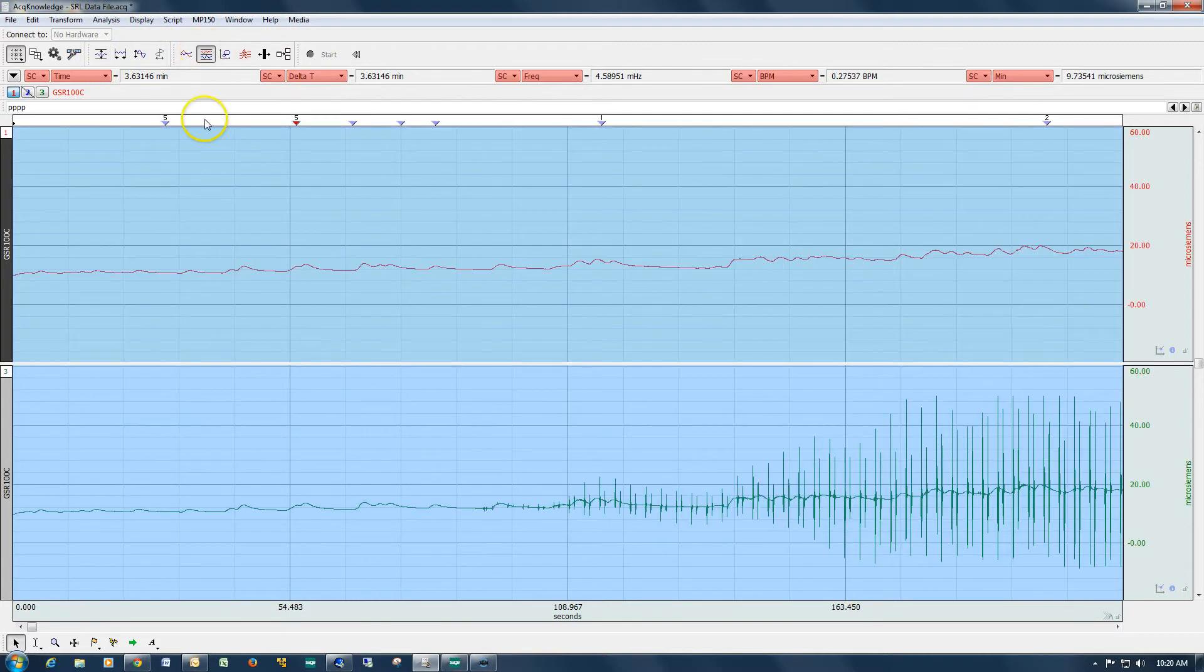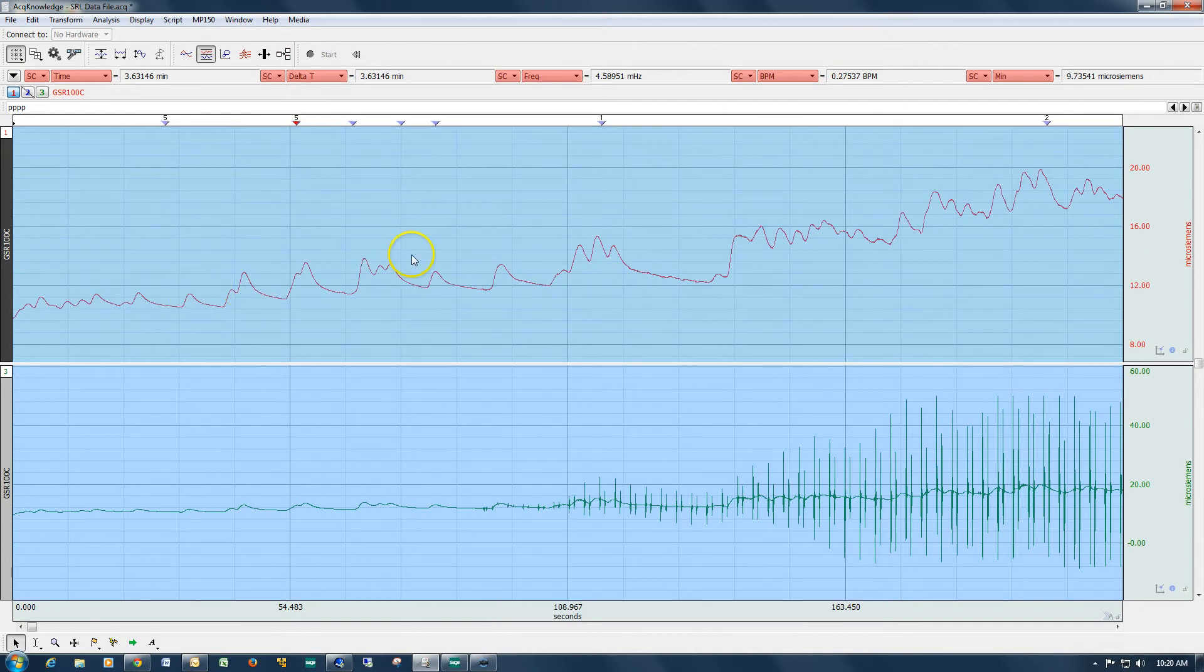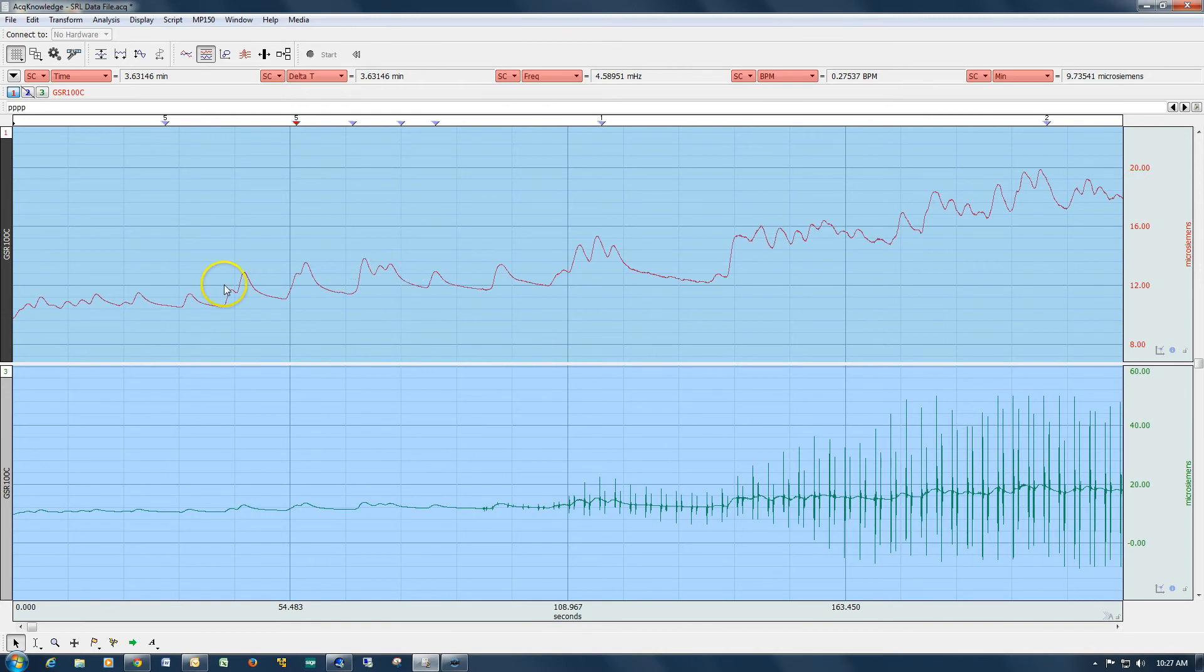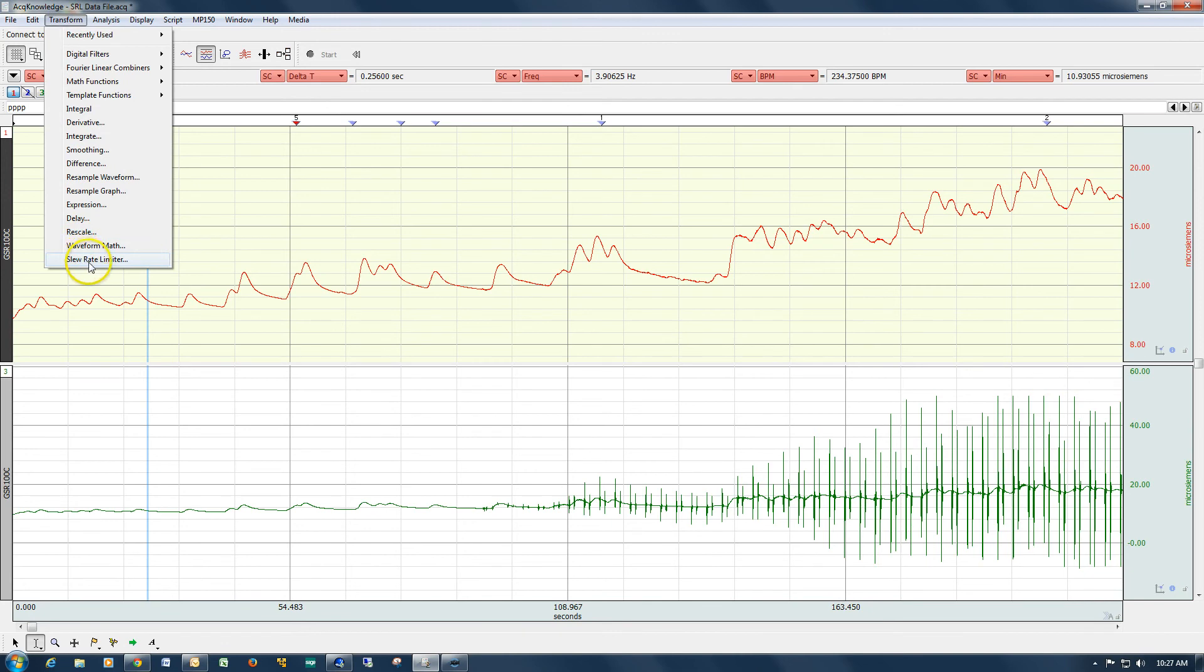So at this point we can now run our electrodermal analysis routine and we can analyze these responses. And that concludes this demonstration of the acknowledge slew rate limiter functionality.